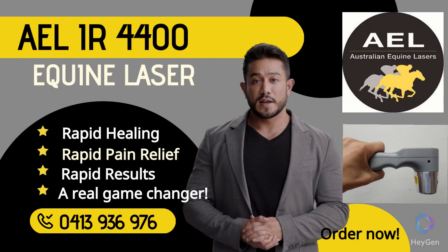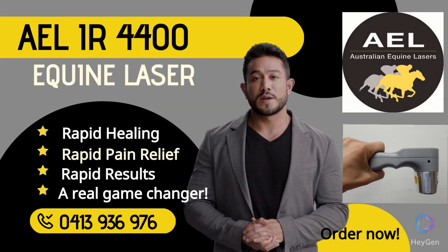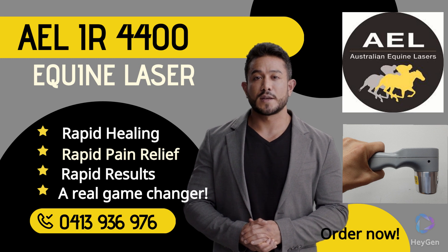The Australian-made AEL-IR 4400 Equine Laser eliminates pain, accelerates healing, heals damaged cells, shortens recovery time, and improves show animal performance.